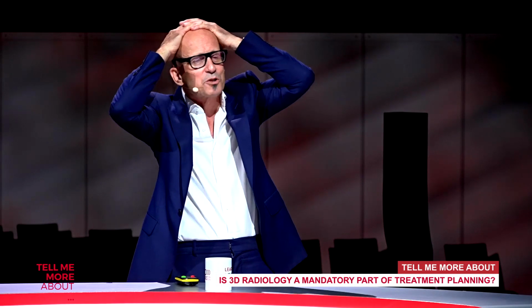It was a single, only loss of one tooth. So relatively a simple case, with two neighboring teeth. Yeah, honestly, I would have placed the implant better freehand. Freehanded, 100%. So looking at the end, he was a little bit too much palatal. I could see it right away. You could see it on the monitor, you could see it during the live surgery. I showed you the picture and said, oh my goodness, this implant is clearly too much palatal.